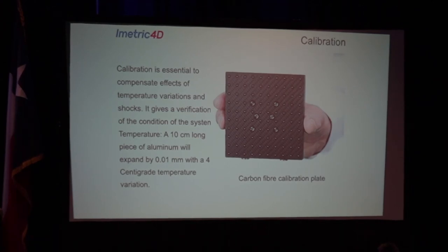This guy's an engineer, and the funny thing is there's people who debate him online, but he's been doing this stuff since the 80s. The Pic system, he was telling me, is like, if you're in Alaska and it's cold, that cable is going to be shrunken more. And even when you warm up your scanner, those wires, once it heats up, it's a little bit different. So he saw I posted a video where I turned it on and started scanning. He's like, Mike, ideally, you want to leave it on because we've tested it to be warmed up for 5 minutes before. And I'm like, shit, I don't think about those things. But he's an engineer, he's thinking about all these accuracy things. So this is a carbon fiber plate. Carbon fiber is super expensive because it doesn't distort, no matter whether you're going hot or cold.